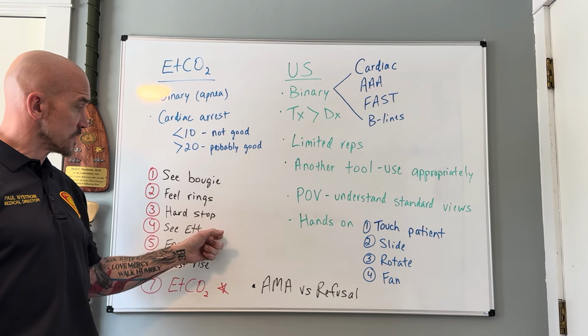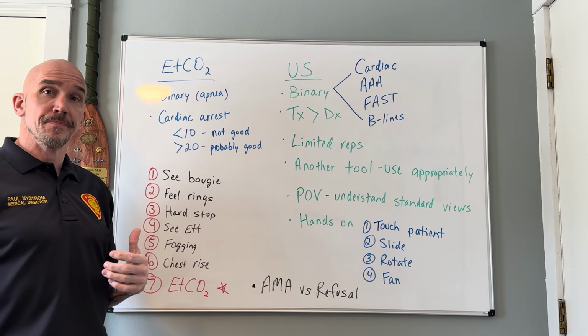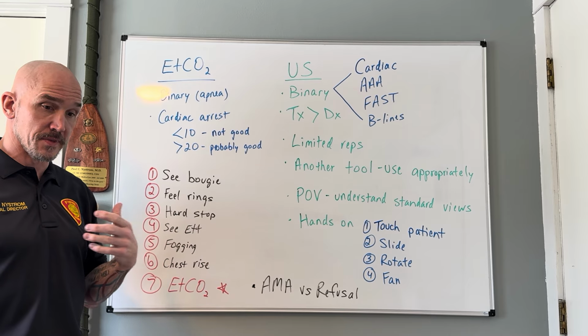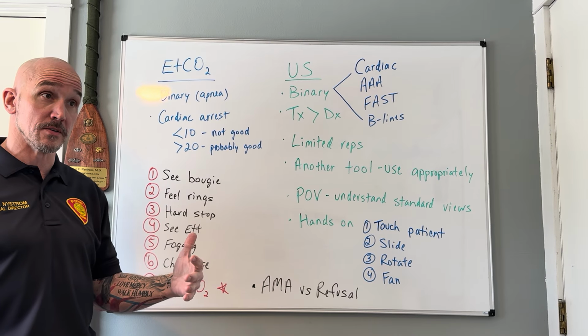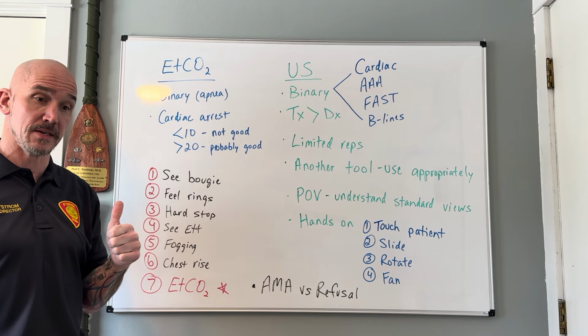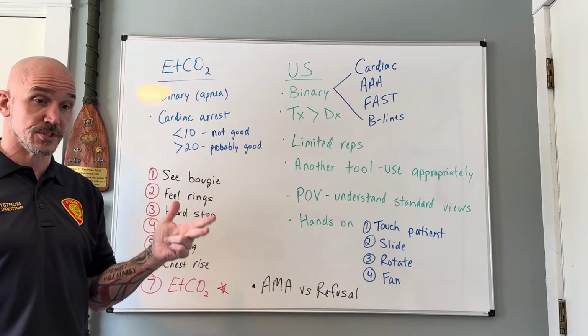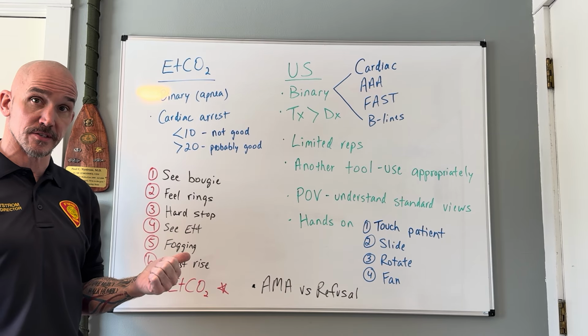So specifically as it relates to intubating, again, we touched on this briefly at training. So this hasn't changed any. As far as I know, this is still how Hennepin is teaching residents. And I still trust the people there doing this, that this is the way to do it. So the expectation every time you intubate somebody is a video and the bougie. Every time. It's still what I do, and this is exactly what I do when I intubate patients still.